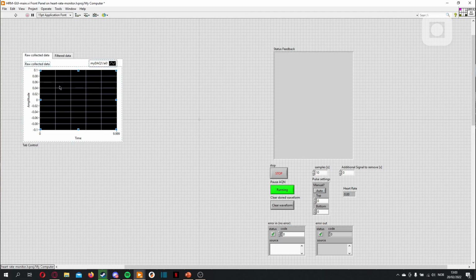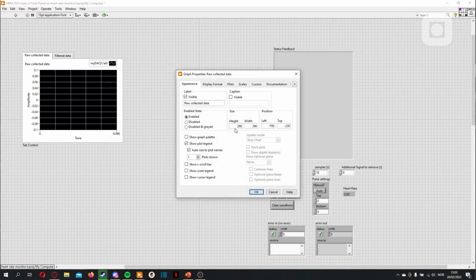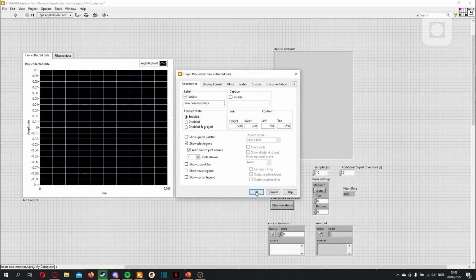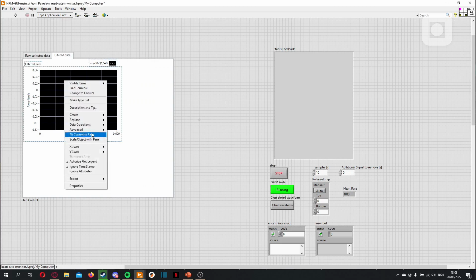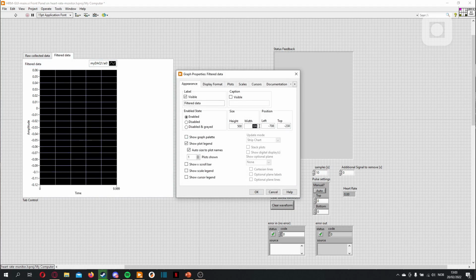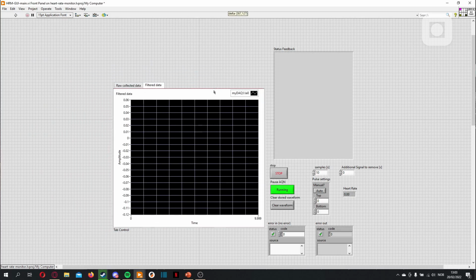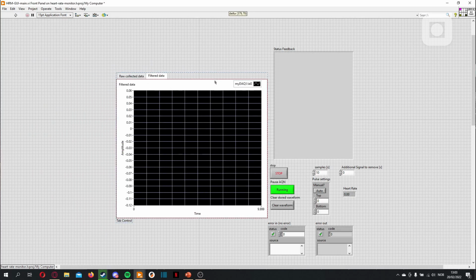We will also make these graphs a bit bigger. Let's just do it in here, because here you can actually set the size rather than pulling them. 500 by 600, that's a nice size. Let's do the same with this one. We use a little bit more space now, but what you can see is that with the same amount of space plus a little bit more, we get a much larger graph, which is nice, because sometimes it's limited how much real estate you have on the screen.